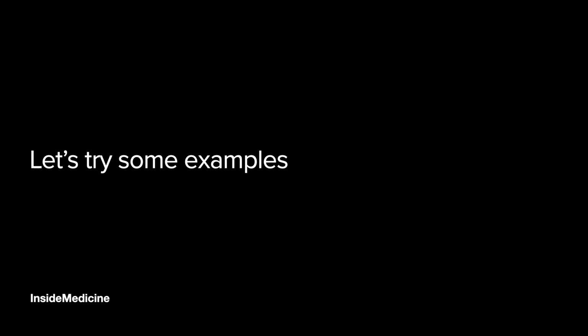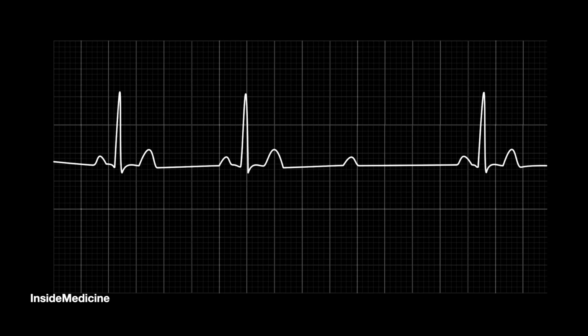So I'm here with my special guest for our new segment, The Hot Seat. He's a senior medical student. I'm going to put him on the spot and see how many ECGs he can get right. I mean, I haven't looked at an ECG in a while, but let's give this a go. Let's see.